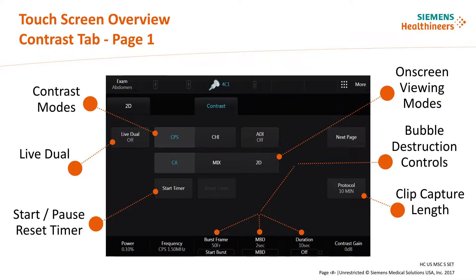All contrast imaging modes, viewing modes, and live dual are located centrally on page 1 of the touch screen. Soft keys at the bottom of the screen contain functions used to disrupt bubble integrity or control freeze behavior of the image during the imaging process. Timer features and clip capture length are controlled or altered from drop-down menus contained on this page as well.